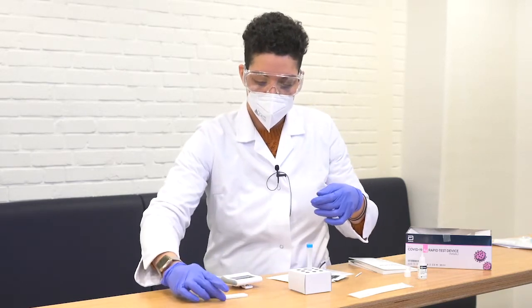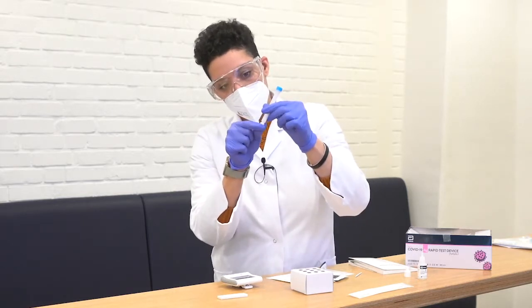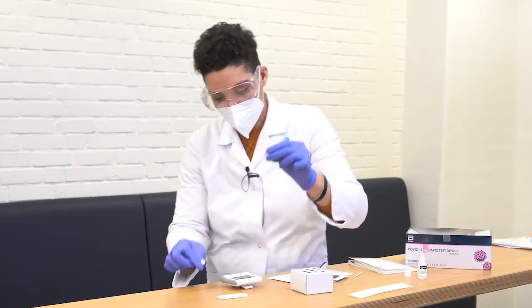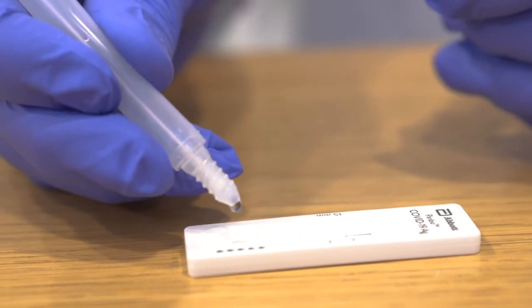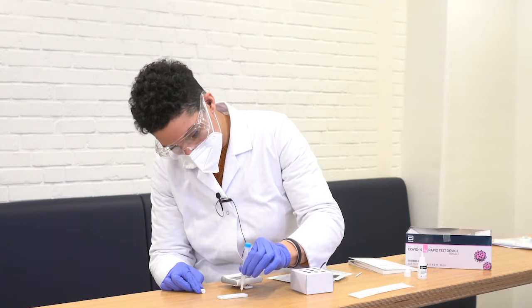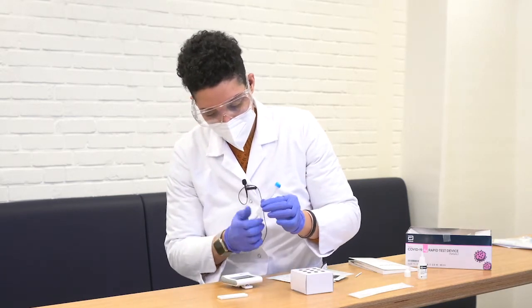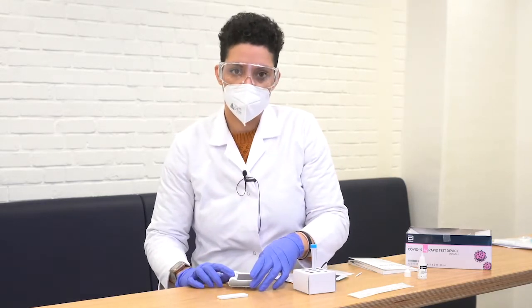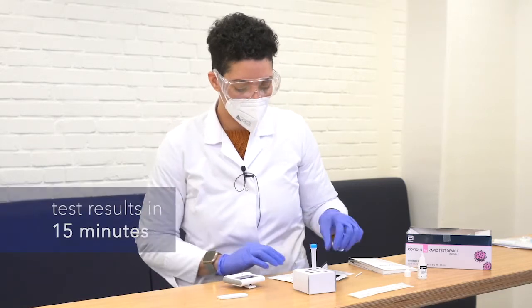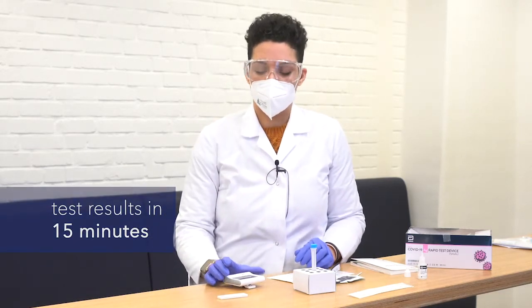Lay the test flat on the surface. Screw the bottom open of the tube. Now you are able to do 5 drops of liquid inside the test. 2, 4, 5. Set the clock on 15 minutes and start. So within 15 minutes, you're going to have your result of your COVID test.